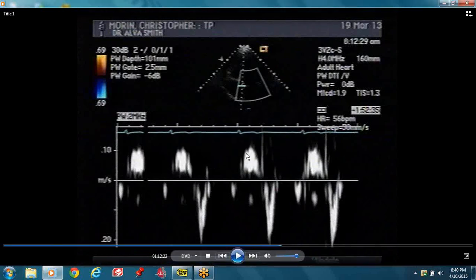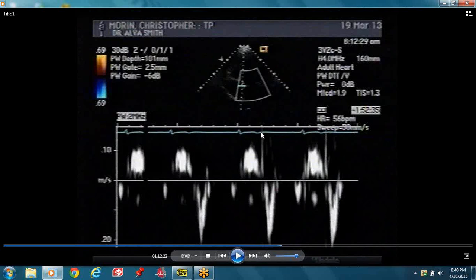You're looking for the velocity of the tissue at the mitral annulus. In systole, the annulus moves up towards the transducer. So this is our S prime wave. Systole is from QRS to the end of the T wave. The tissue moves up in systole.